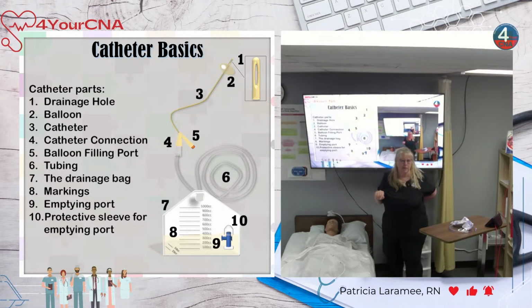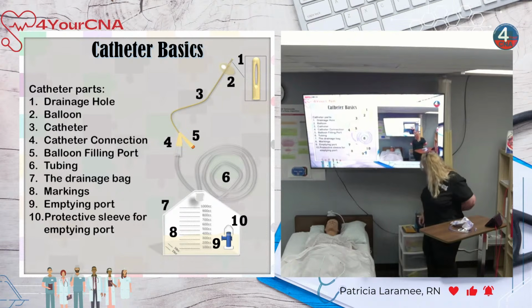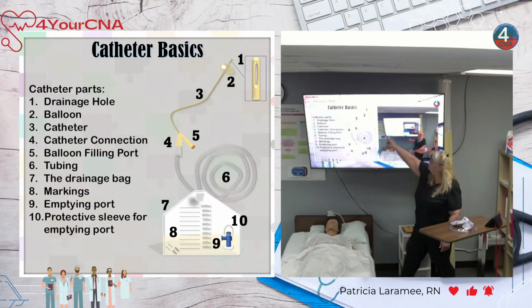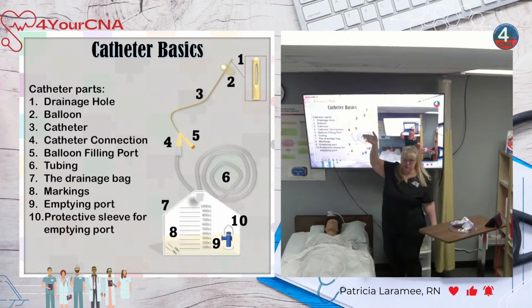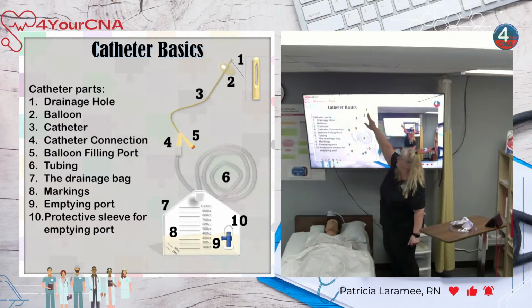Fun fact, catheters used to be glass. When they were first invented way back when, they also used to be shaped like an actual straw. But we found that these are kind of hard to put in, right? So somewhere along the line, somebody said, hey, if we enclose that and put the hole on the side, might get us a little further. So, you know, medicine is a work in progress. Of course, this was 200 years ago, guys. We've advanced since then.